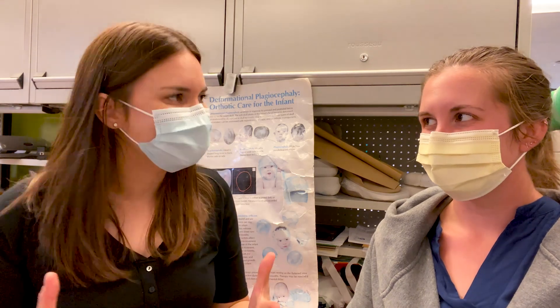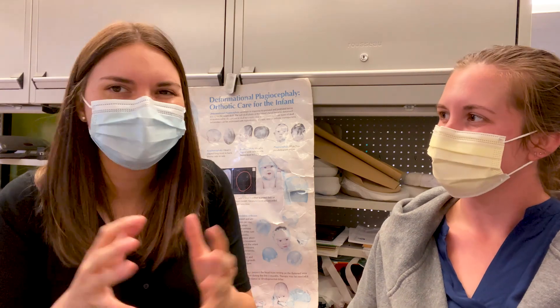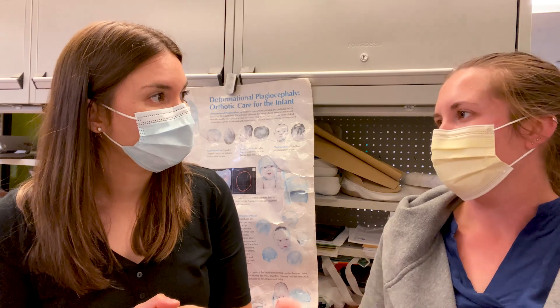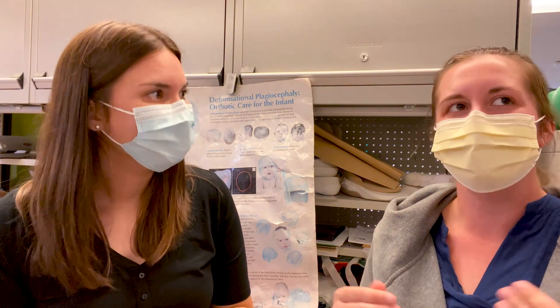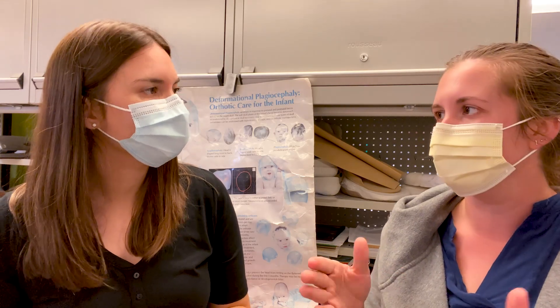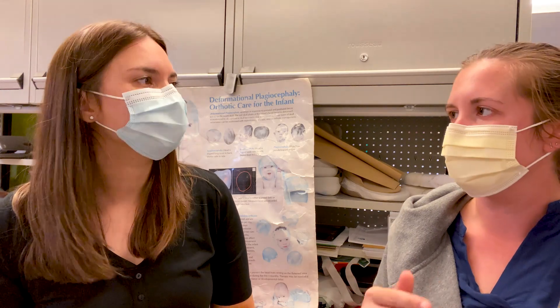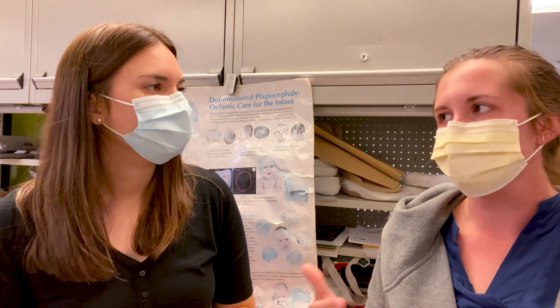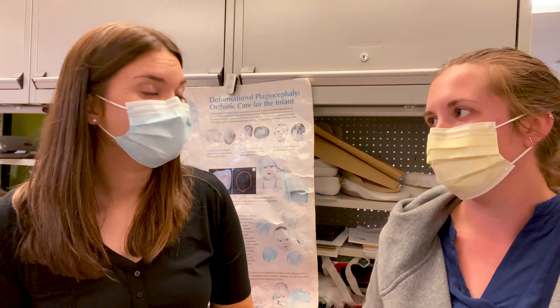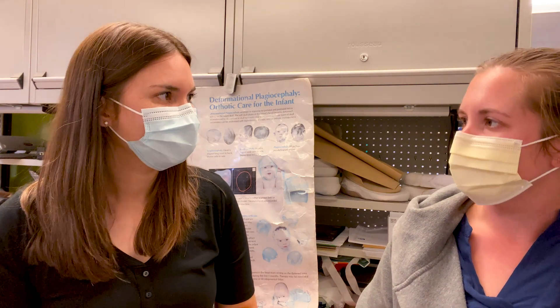That is such an amazing result — incredible. How long does the baby have to wear the helmet? We say it's about a 23-hour wear helmet. The babies are growing all the time, so to make sure they're growing into the space we want, it's on all night, off in the morning for cleaning, might come off a couple of times during the day to get wiped out, off again for bath time, then back on. Average about four months that they're in the helmet.